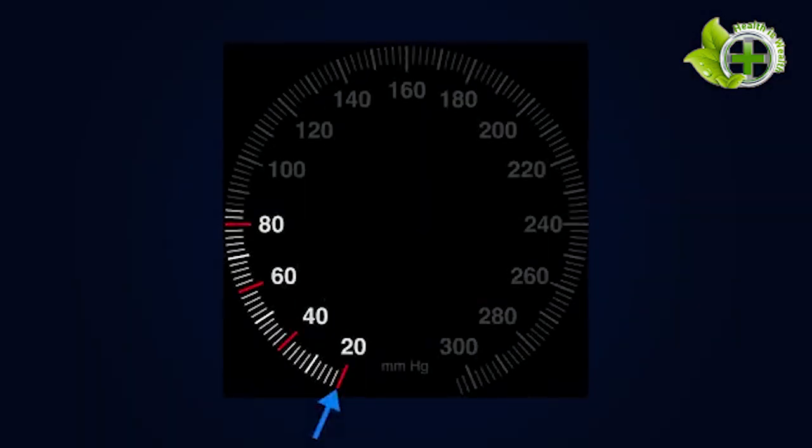The largest lines represent values of 20. This is 20. This is 40, 60, and so on. The medium lines represent values of 10. This is 30, 50, 70, and so on. And the smallest lines represent values of 2. So this line represents 22, 24, 26, 28, and so on.